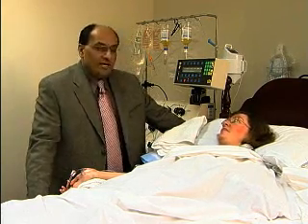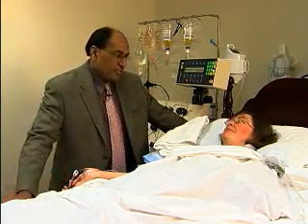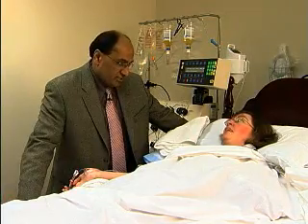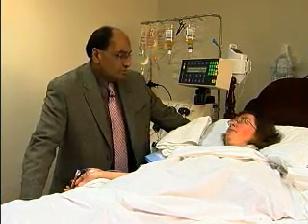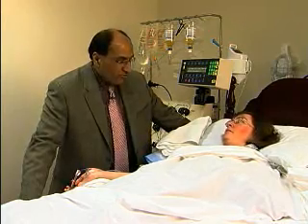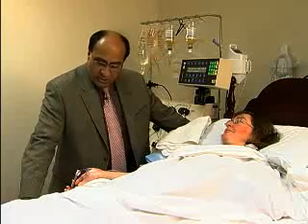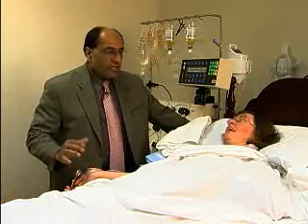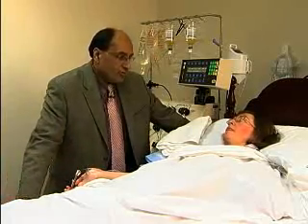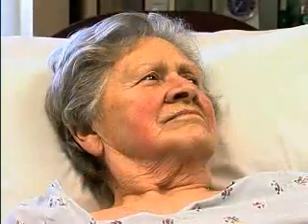Yes. Right, okay. And we have been using your right wrist for the arterial access every time. Yes, every time. And you haven't had any problems? No. Was that painful? No, it's not painful at all. No, okay, good. So we've been using this right wrist, right radial artery once a month for about 5 years now. 5 to 6 years actually, isn't it? Yeah, good.